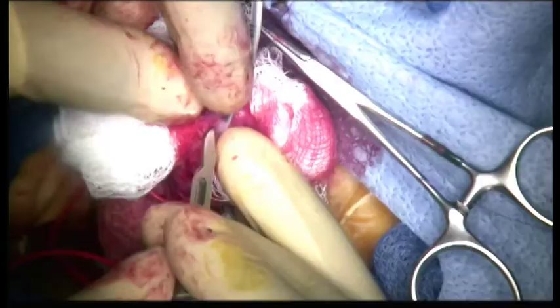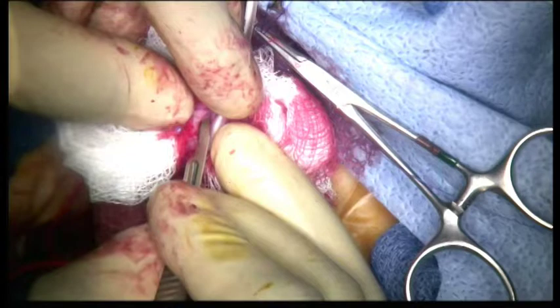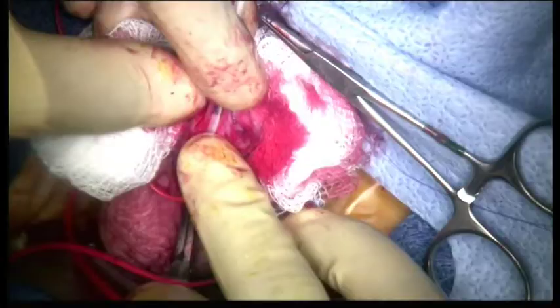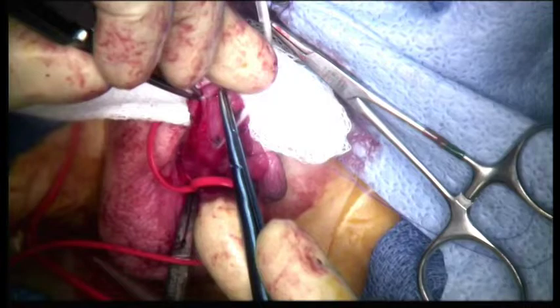There are a number of ways to achieve urethral reconstruction including urethral advancement or a flip-flap technique. The neourethra is created by tubularizing the urethral plate around the feeding tube using a subcuticular suture.